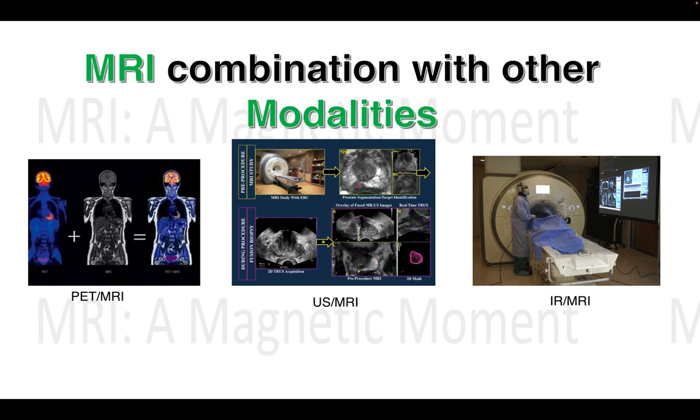And then we have ultrasound MRI. It's another useful combination for various diagnoses, and it's becoming more common in hospitals for biopsies and surgical interventions. Then we have this interventional MRI.